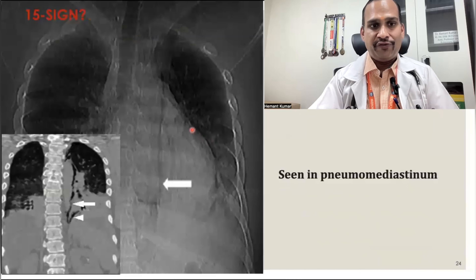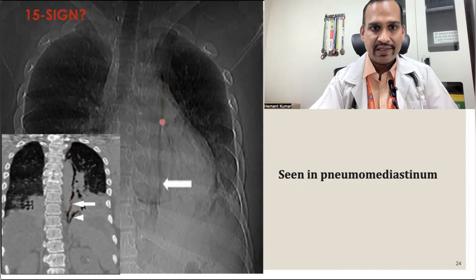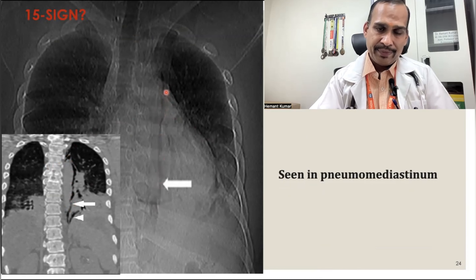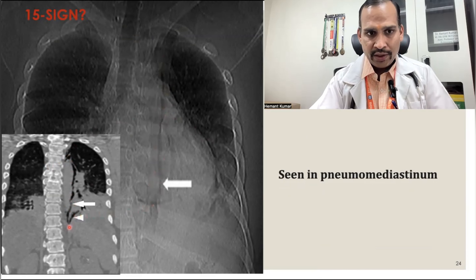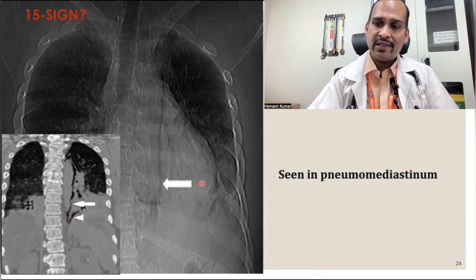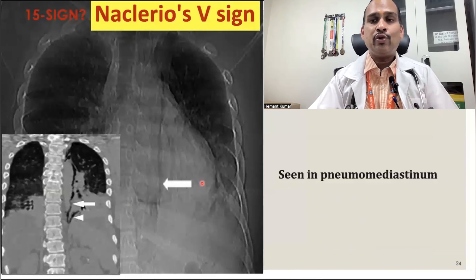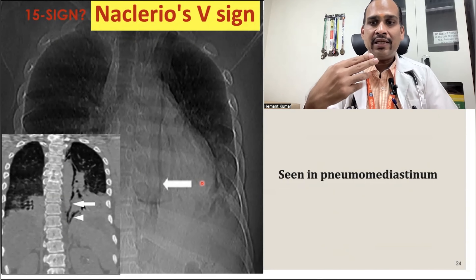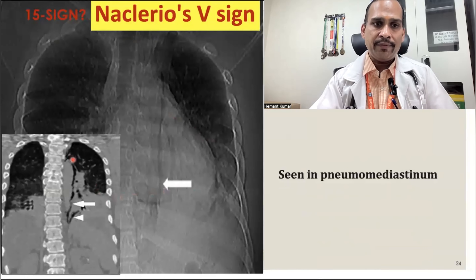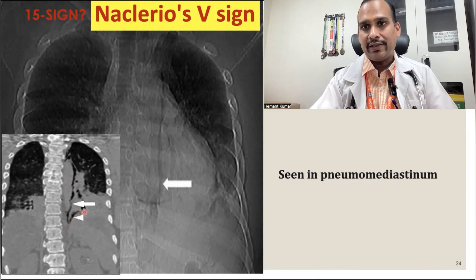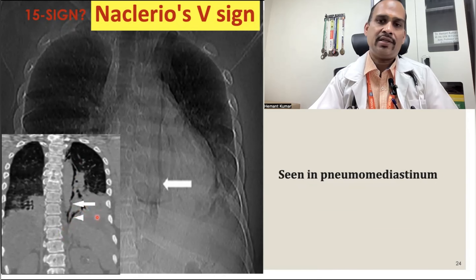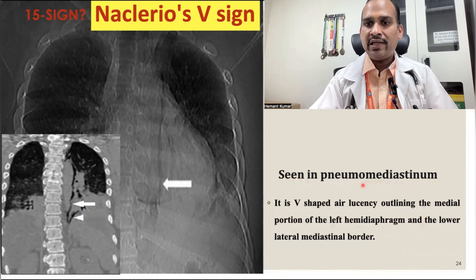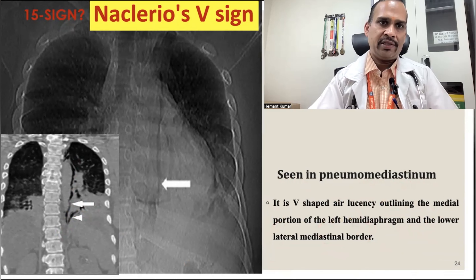Sign 15 is the Naclerio V sign. You can see hyperlucency beside the mediastinum continuing towards the diaphragm, on the left heart border. This is also seen in pneumomediastinum. There is an air column at the border of the mediastinum, below the heart on the left side. This is a V-shaped air lucency outlining the medial border of the left hemidiaphragm and the lower lateral mediastinal border — the Naclerio V sign.